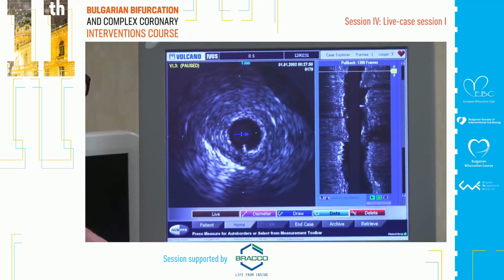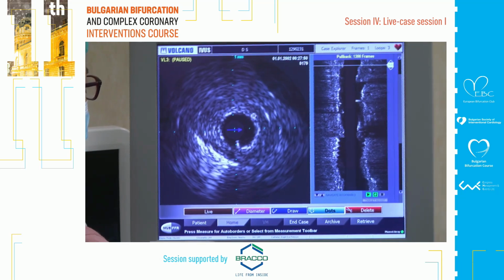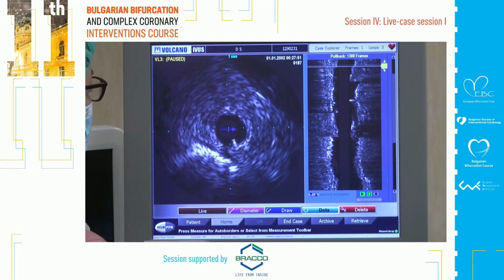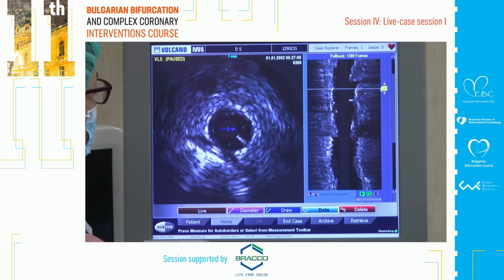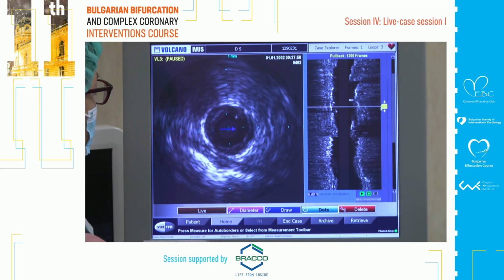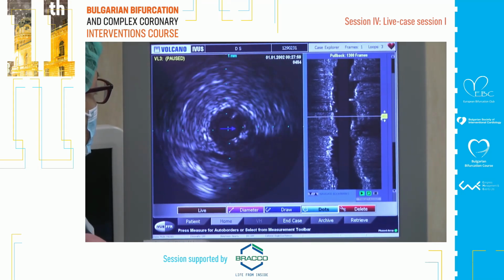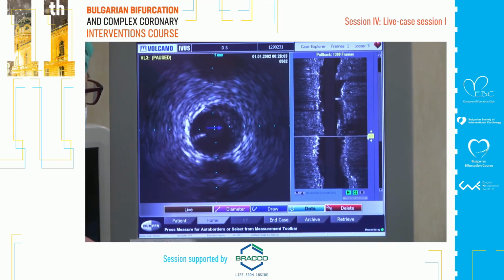Okay, so this is super distal, by the way. And this is a pericardium. So the diagonal should be this way and the septal this way. So let's pull back from super distal. And this is completely normal. This is a diag, which is super distal. And this is a normal segment, which is a nice landing. That's a good landing zone. This is soft plaque and some calcium and some disease, but this is also normal.